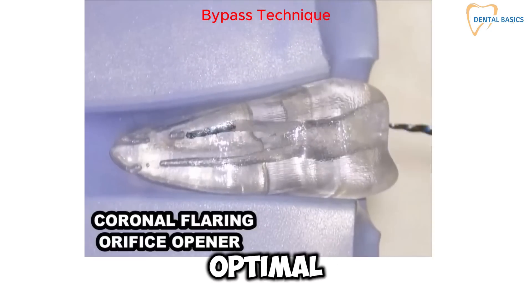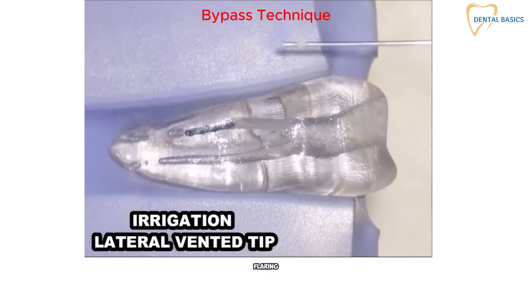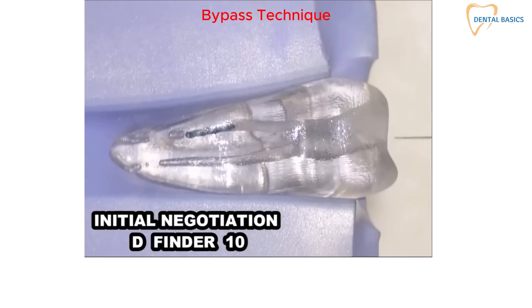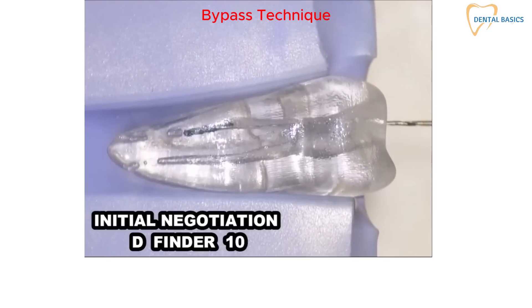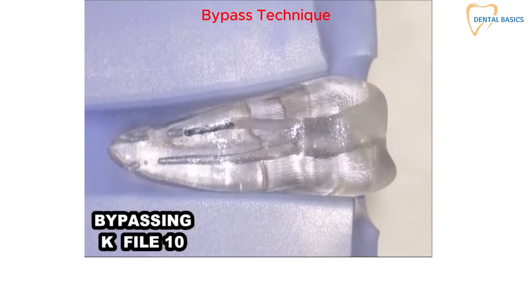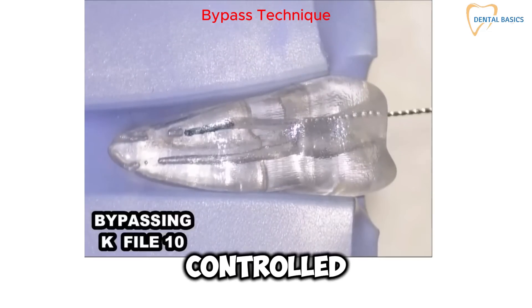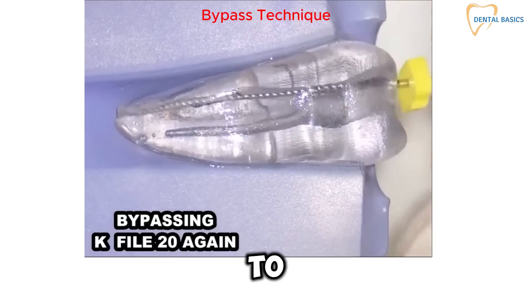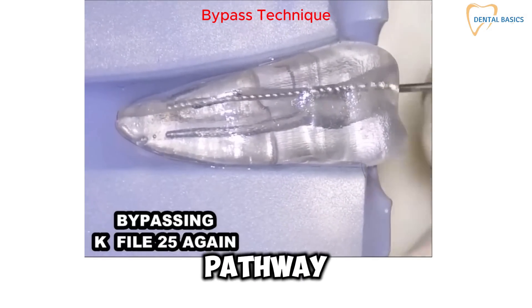Access and exposure: establish optimal straight-line access through coronal flaring to enhance visibility and accessibility of the canal. Initial negotiation: utilize a stiff file or D-finder to gently engage the canal with short, controlled push-and-pull movements. Obtain a radiograph to confirm the file's position within the main canal pathway.